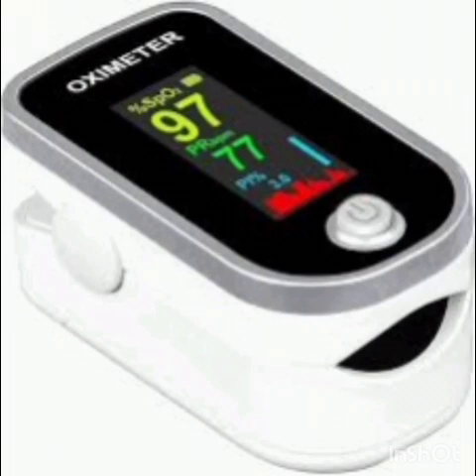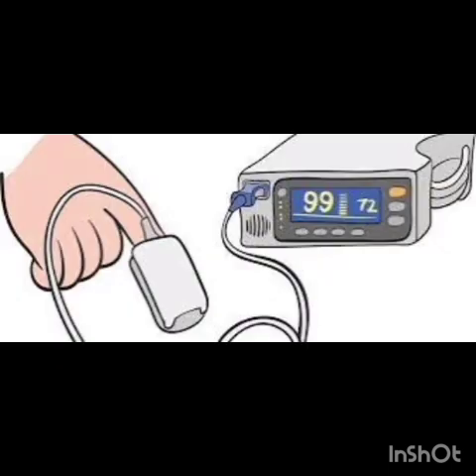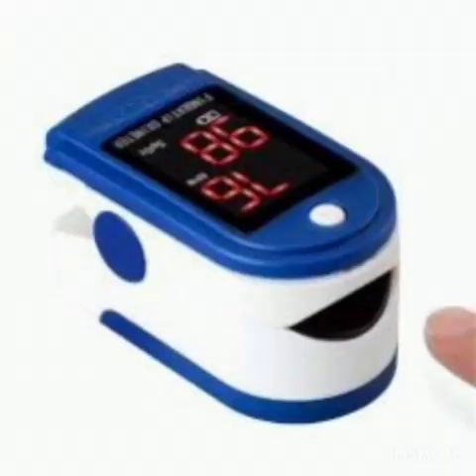Pulse oximetry is particularly convenient for non-invasive continuous measurement of blood oxygen saturation. The pulse oximeter is useful in settings where the patient's oxygenation is unstable. Oximetry is useful in any setting where patient oxygenation is a concern. It is mainly used in the operating theatre, recovery room and the emergency or hospital ward. It is mainly used in patients with COVID-19, where the pulse oximetry helps with easy detection.